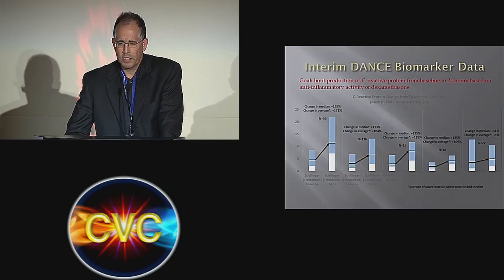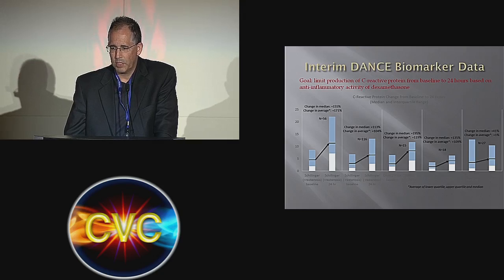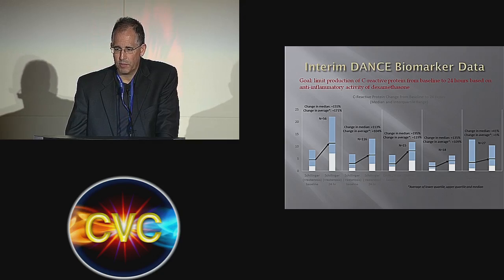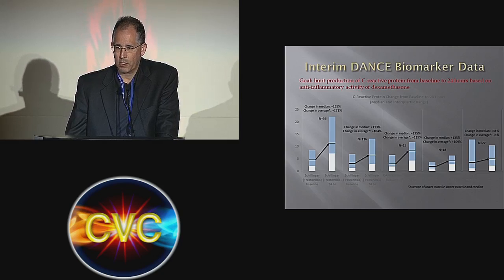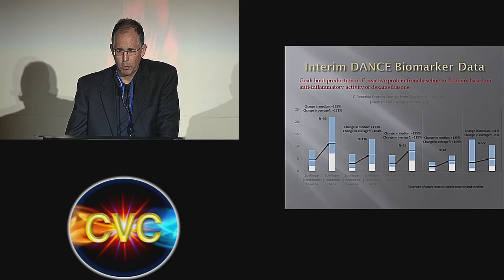One of the other things that will be followed is an evaluation of the inflammatory markers. I'll walk you through this slide, but I think it's a very instructive slide about what the device does. In the very first column, when we treat someone with any vascular procedure, you see an immediate increase in inflammatory markers, and that's measuring CRP. The very first column shows the typical jump that we see in those markers in people that restenose. The second column represents patients that do not restenose.